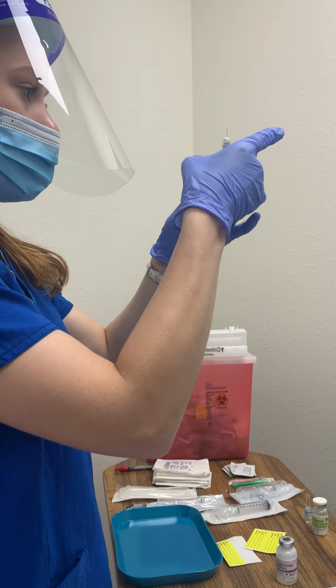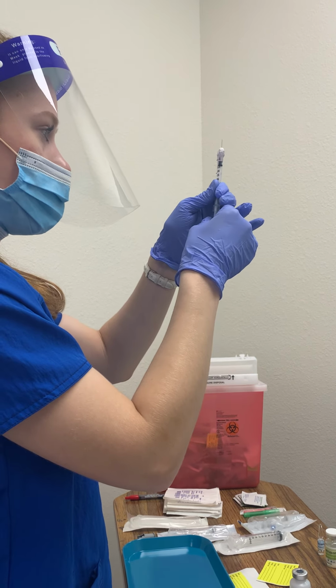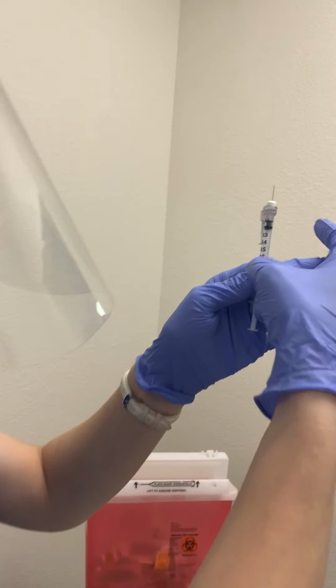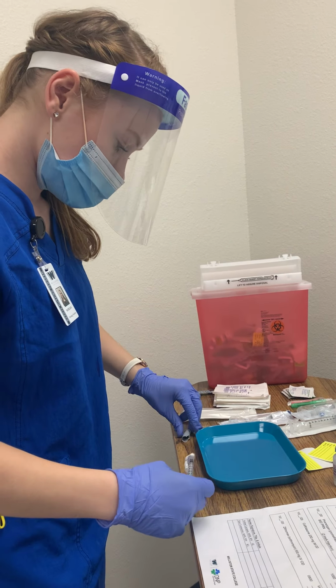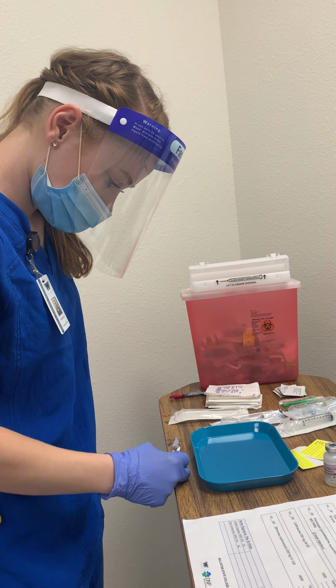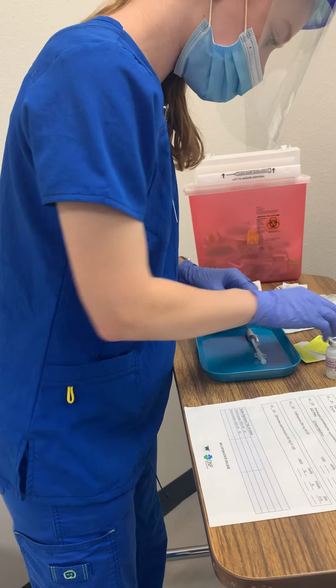So I'm gonna be flicking the bubbles out, and then pushing back to that mark, 0.1 mL. And then I'm gonna be doing my one-handed scoop, closing at the base, not the tip.